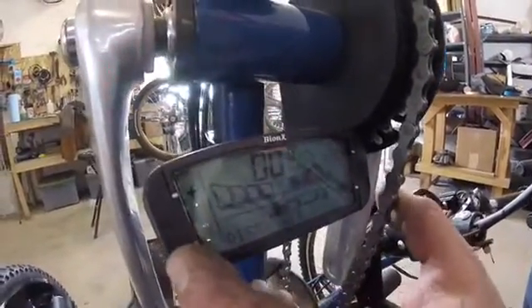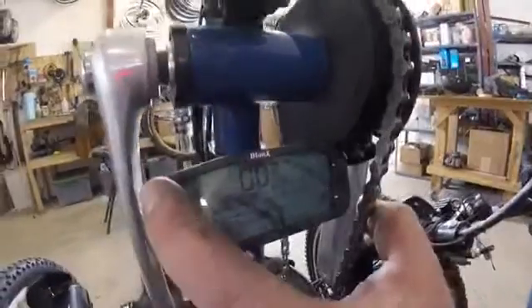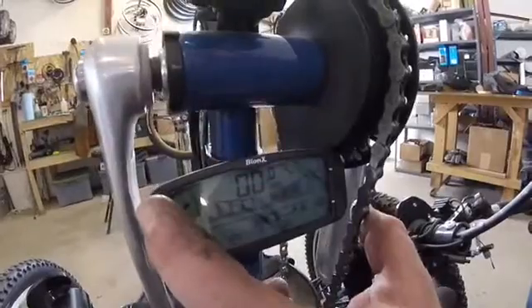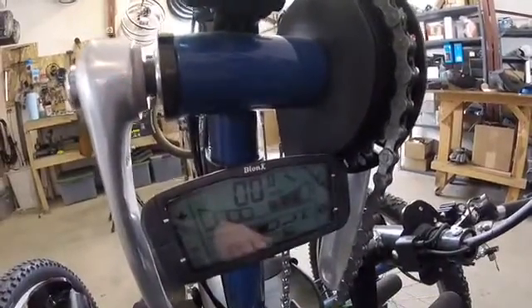If you turn it down, this is a regenerative mode. We'll turn it back up to assist mode. You have to start going two kilometers per hour and then the electric assist will start helping you pedal.